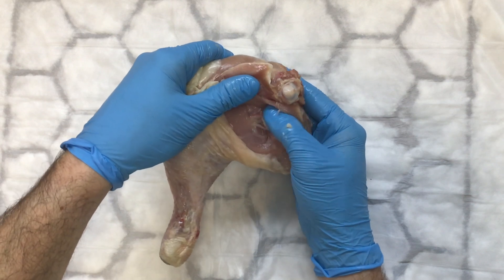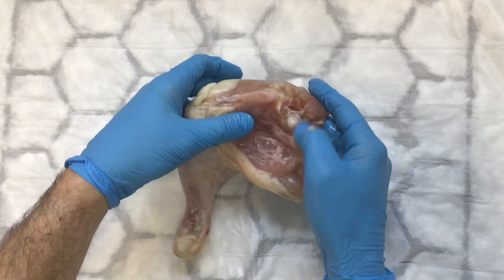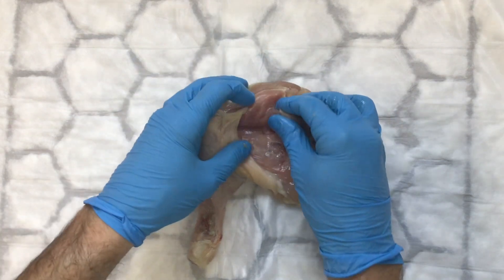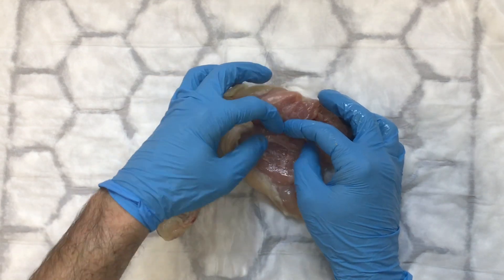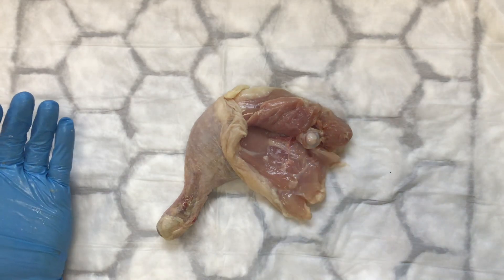You would expect to find a nerve, an artery, and a vein, and we can see that quite nicely in there. Blunt finger dissection is often the best way to do this, not only in the simulated setting but in real life as well. There we go — we've got our vessels with a simple manoeuvre like that.